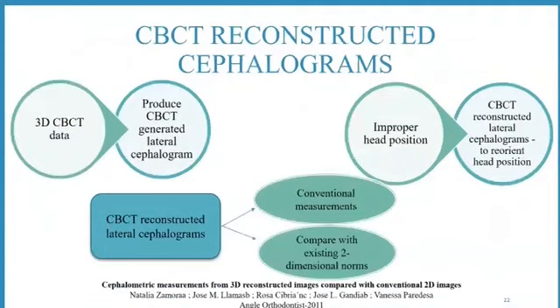CBCT reconstructed cephalograms. The aim of the study was to assess whether the values of different measurements taken on 3D reconstructions from the CBCT are comparable with those taken on the 2D images from conventional lateral cephalometric radiographs, and to examine if there are differences between the different types of CBCT software when taking those measurements.